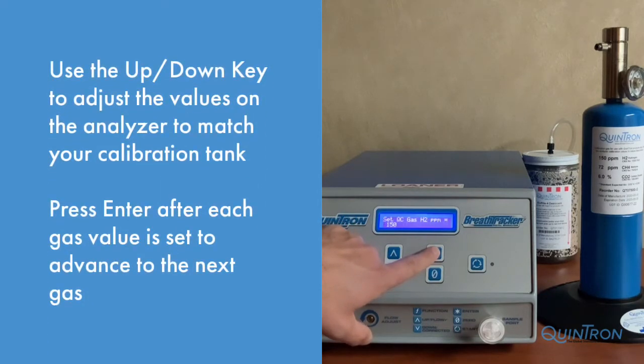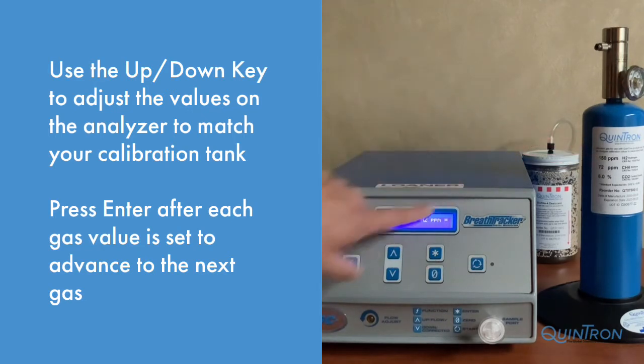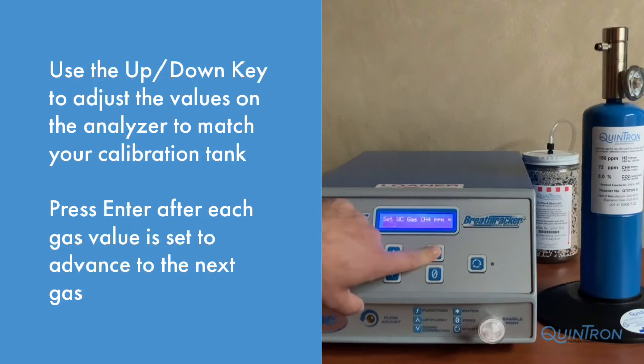Once you've accessed the Data menu, you'll need to adjust the calibration gas values for the machine to match the tank. Use the up or down arrows, then press Enter. You'll do this again for all the gases listed on the gas tank.